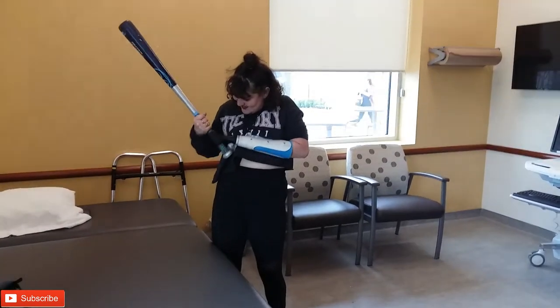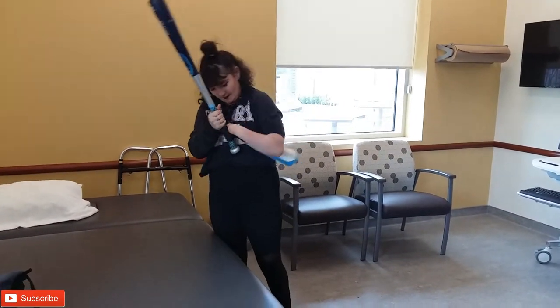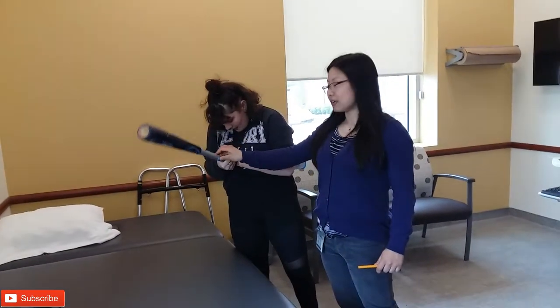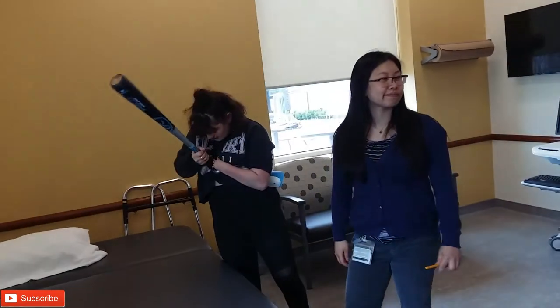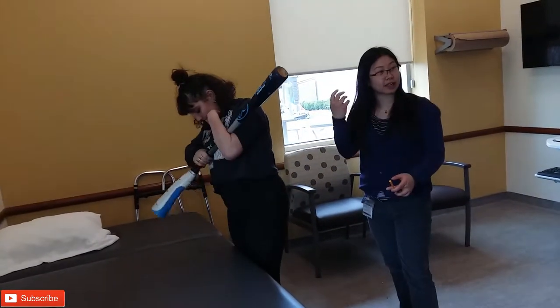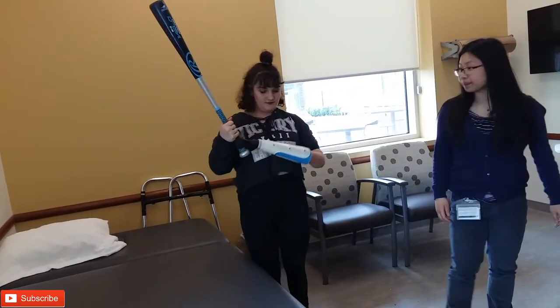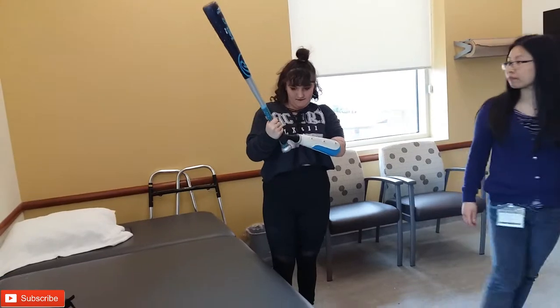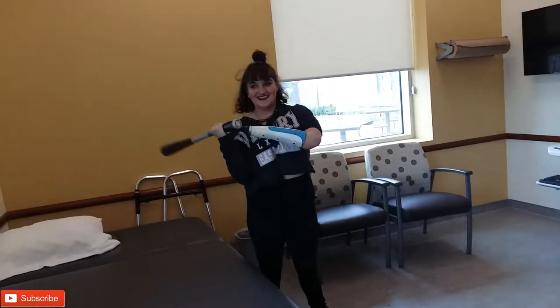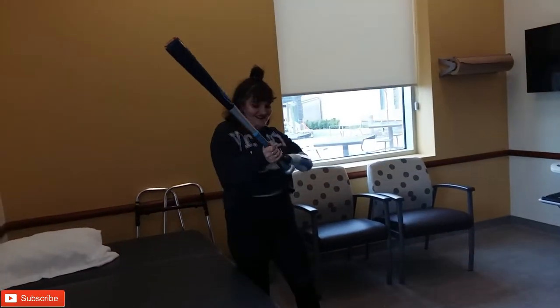Is getting it back on an issue? Yeah, getting it on is a little bit awkward — this one's a bit tough because it has the grip on it. Most bats likely have the grip though. Not my bat. So Aaliyah has her own bat, so she can take the grip off and make it easier to slide in. Yeah, that would be good. Got it. I like it!